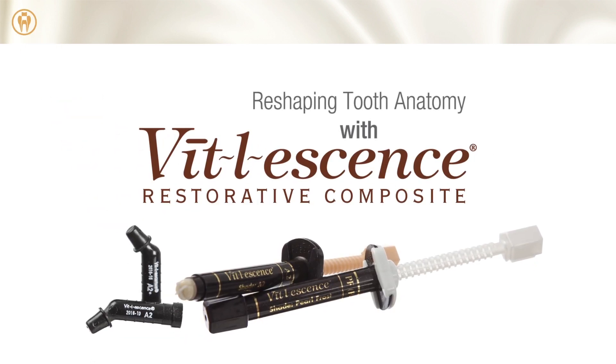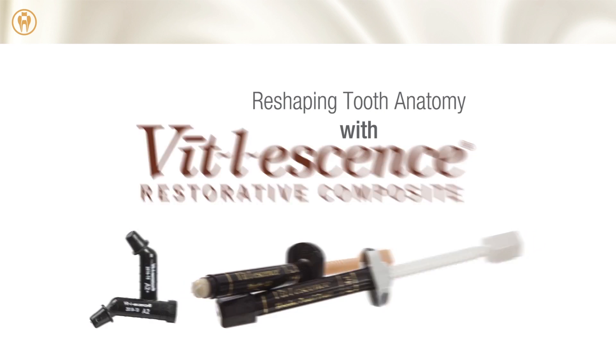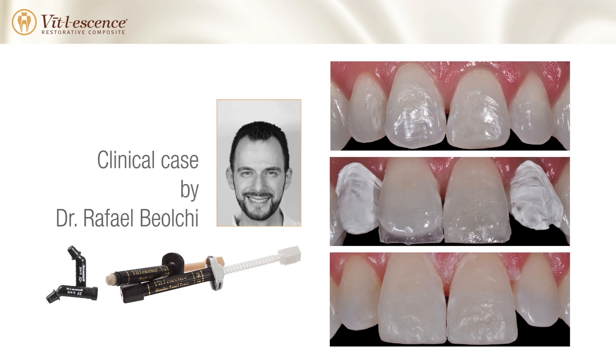Vit-l-escence enables you to create lifelike restorations to perfectly match any patient's smile. This case by Dr. Rafael Beolchi demonstrates how to produce natural results using a combination of shades within the Vit-l-escence system.